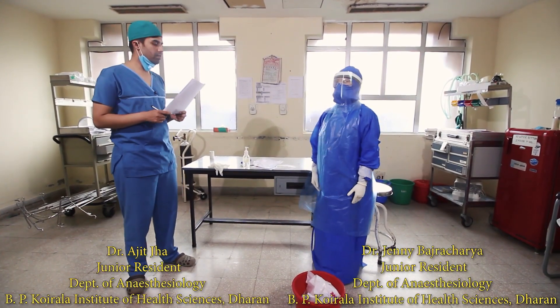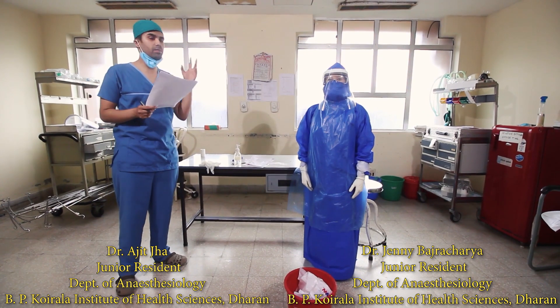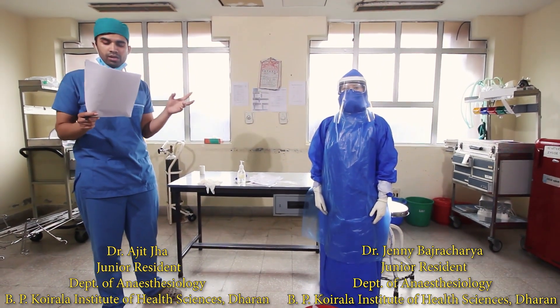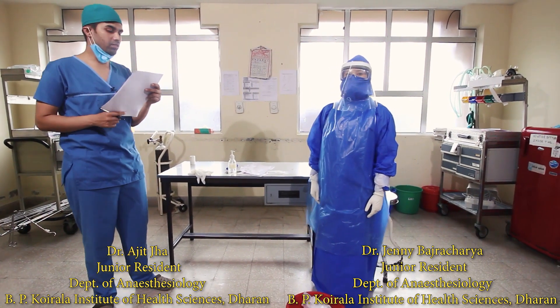Now we will move on to doffing the gown. This is done in three phases: first in the patient room, then in Area 1, and then Area 2. We shall move on with the checklist as follows.